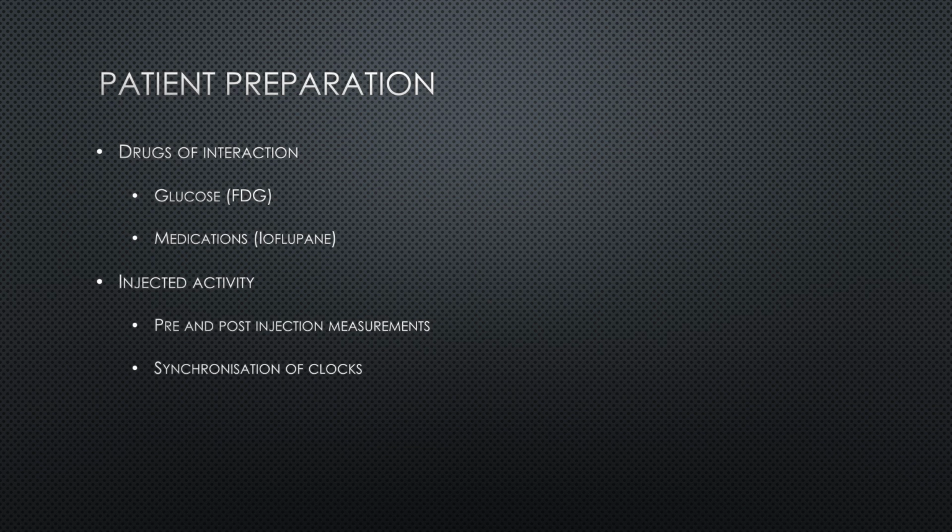And we also need to synchronize the clocks in the area we're injecting and the clocks on the scanner so that any time difference between injection and scan is measured accurately. And of course, if we're doing SUV measurements, we need to normalize the activity to the body habitus a little bit. So we need to measure weight generally, or height is another thing we may measure.